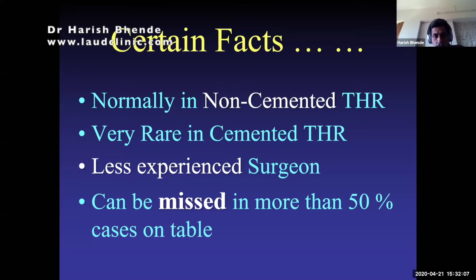It actually was not even noticed on the immediate post-op X-ray, but we saw that thing opening up on the third or fourth day when the patient was walking. So it must have happened during operation. It cannot happen afterwards. So it can be missed in more than 50% of cases on table.